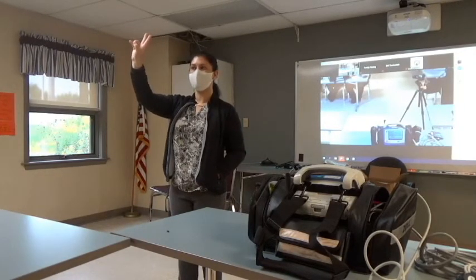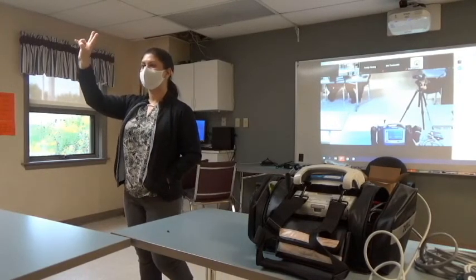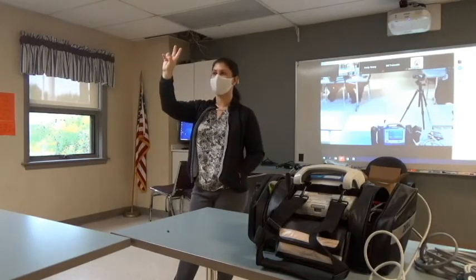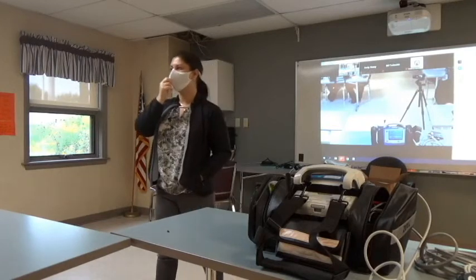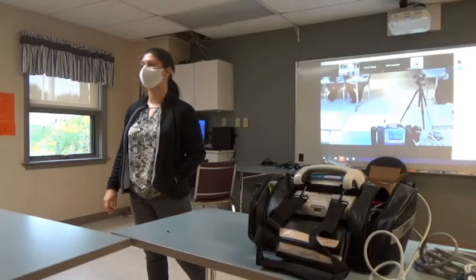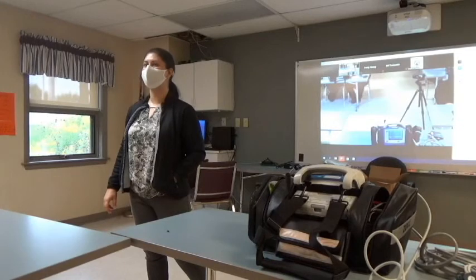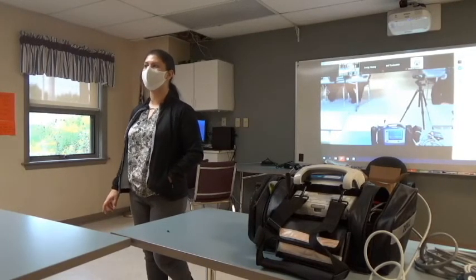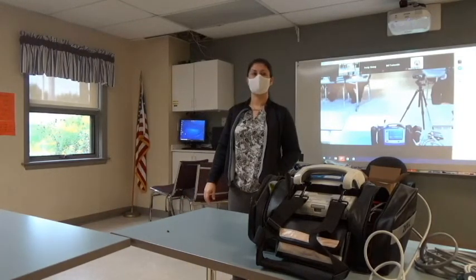Step number two is going to be your output. So to adjust your milliamps, you're going to slowly hit your arrow until you get a blue pacer spike in front of every green QRS. I'll give you guys a hint on the rhythm generators. It's somewhere around 70. If you're way above that, you may have hit the button pushes a little too quickly. And then go up 10.